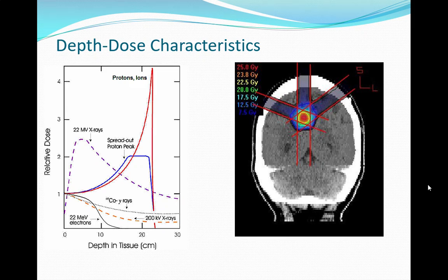So as you do it, you're stacking them up, and it stacks up a little faster on this side as you're moving over, because you're kind of pushing this curve further and further. So later ones are going to be a little bit higher up on the spectrum because you have to start them at lower energy. But it allows you to get a flat area. And if you imagine this as your tumor width, generally a doctor says, I want so much gray in this particular area, let's say like 60 gray or something of that sort, which should be quite sufficient to kill most things, but it wants it pretty spread across that whole thing.